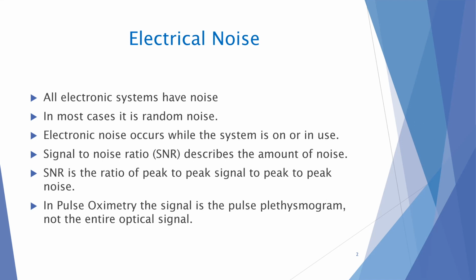I was curious, how many subjects actually showed that bias? What did it look like on the repeats? You guys analyze the repeats. So I can tell you that the bias varied between the same subject on different days, depending on their perfusion index. That was one of the powers of the study: we captured data from the same people under different conditions, and that was accounted for in the model that we used.